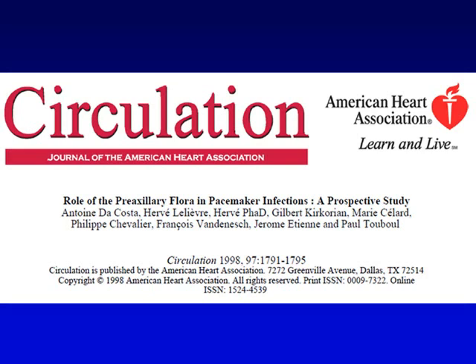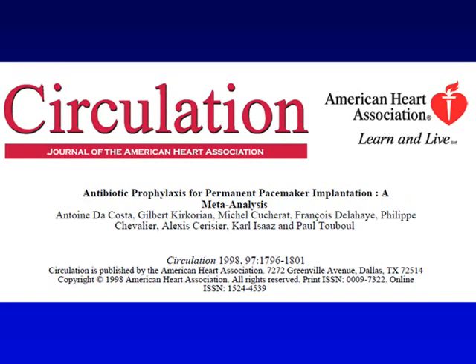But I must say this is something we don't do, and as I reviewed this material in preparation for this, I said, maybe we should do that. Any infection, of course, is a calamity with a device, and anything we can do to reduce such infections is excellent.